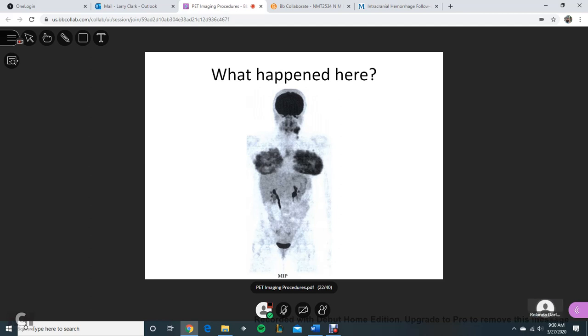So now the next question is, can a woman who is breastfeeding have an FDG study? Depends what it's for. So she could pump and dump?